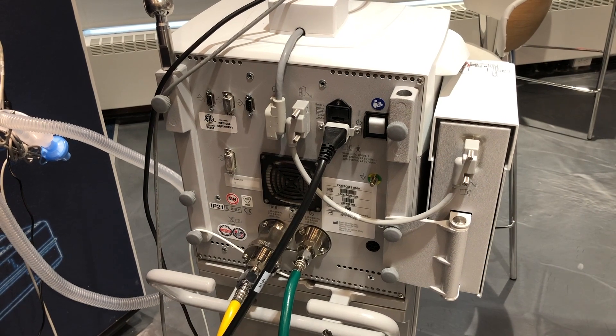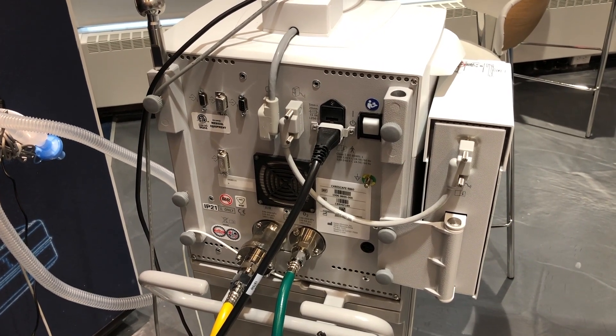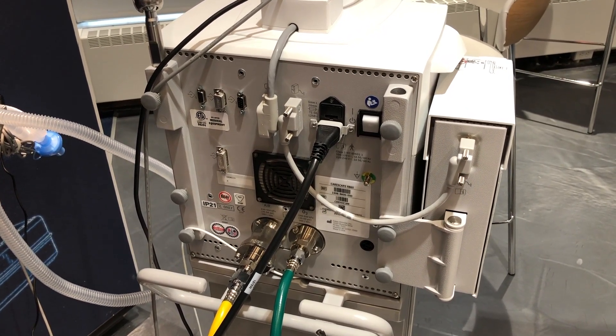If the ventilator is turned off during ventilation, an alarm sounds and ventilation and monitoring continue. This ensures the ventilator cannot be accidentally shut off during ventilation.